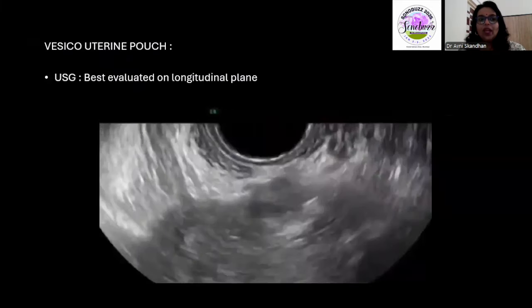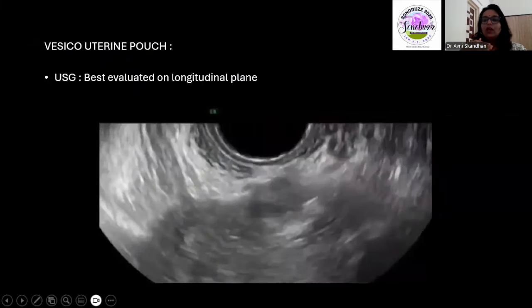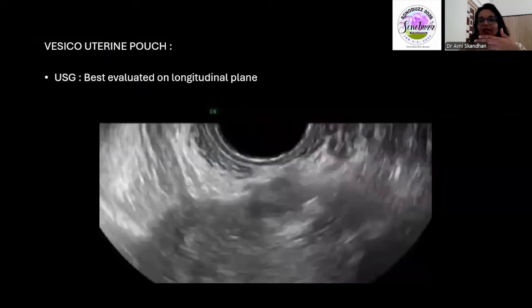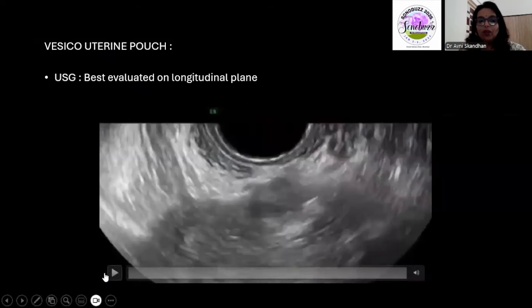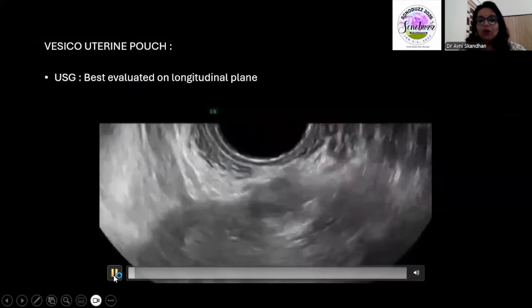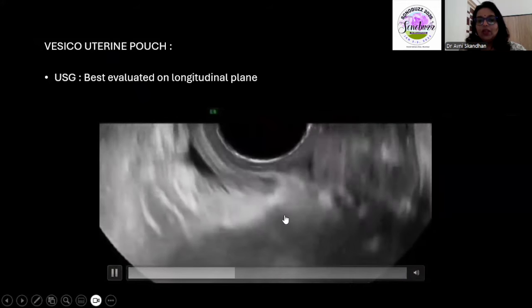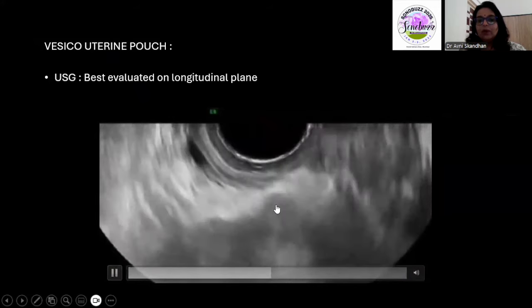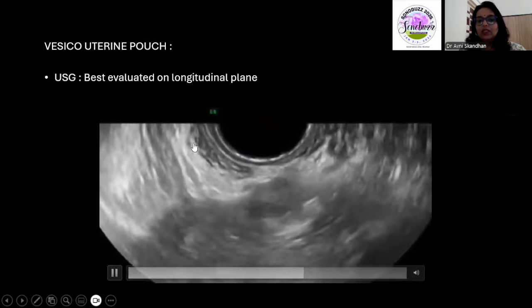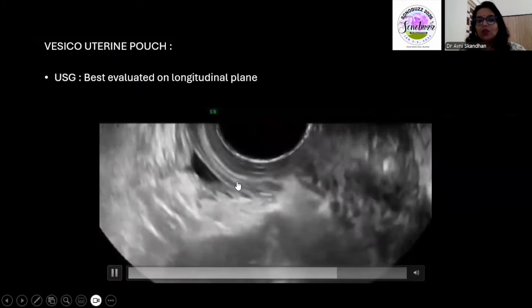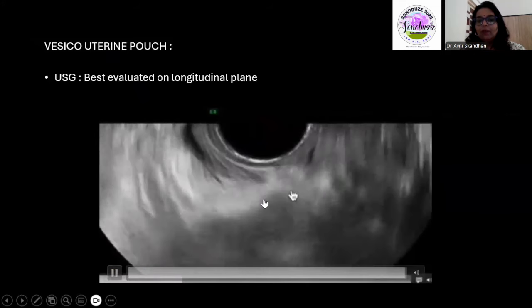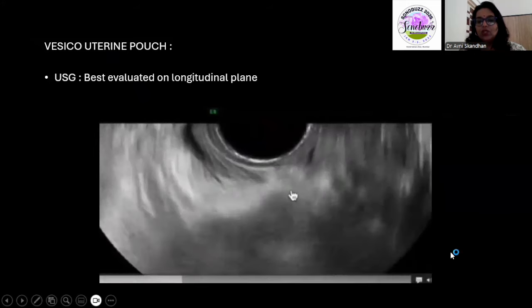Next we have the vesicouterine pouch, the space between the bladder and the uterus — another important area to look out for. Here you can see the uterus, a deposit in this region, and the compressed or collapsed bladder with the deposit visible in this space.